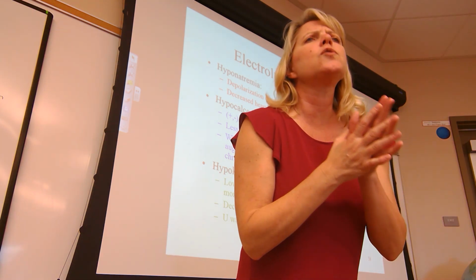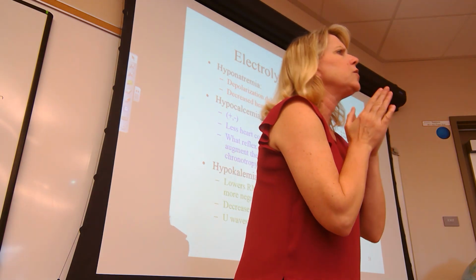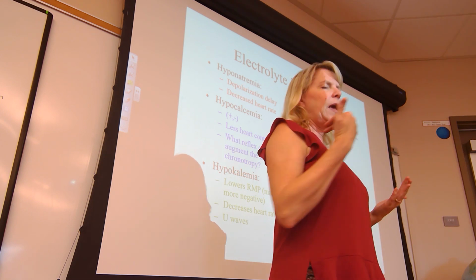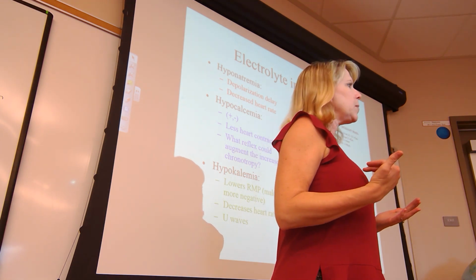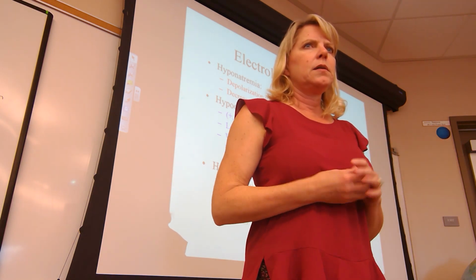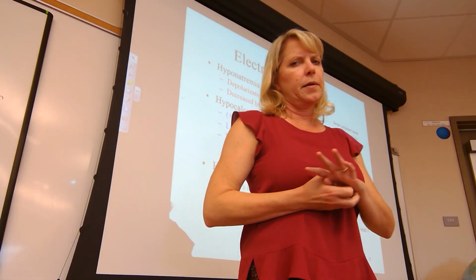I do not ask you to explain the U wave. I merely want you to know that the U wave is an outcome if a person has hypokalemia. That's it. It's a matching question. Good? Yes? Okay.